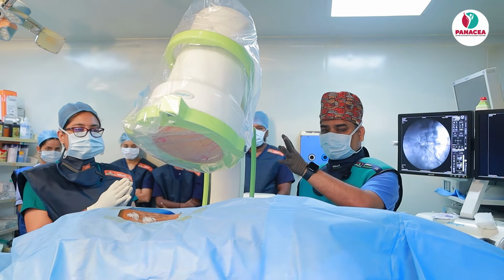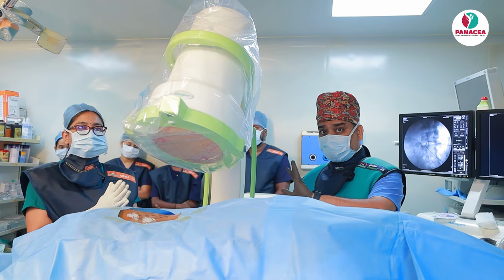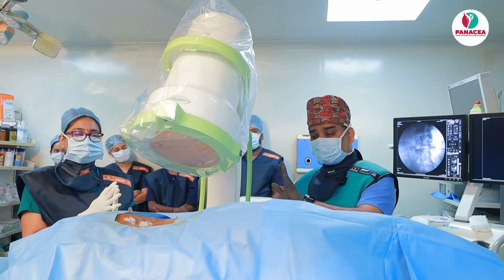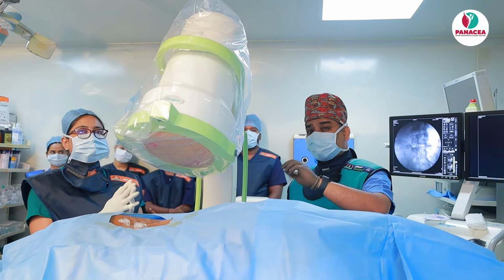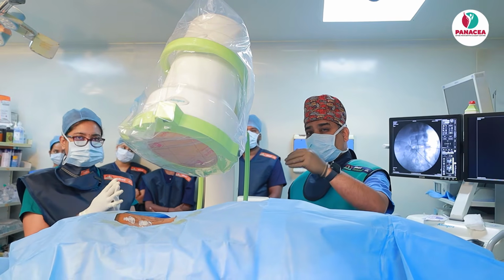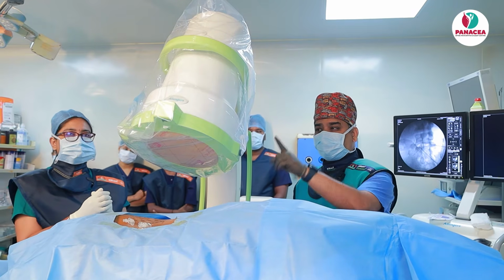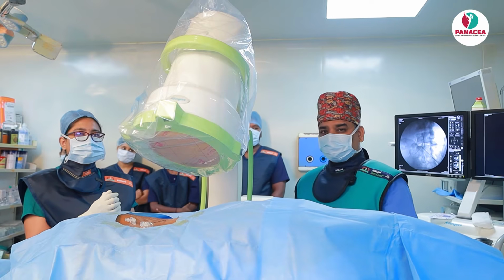Now you see the fluoroscopy. Now we have put the fluoroscope in oblique view. We have taken almost 30 degrees. There is no hard and fast rule. It should be 30, it could be 35, it could be 25. Already I told in my previous videos, we have to tilt it till the spinous process is pushed to the opposite SAP-IAP junction. So now we have put exactly 30 degrees for this patient. Let us see the fluoroscopic image.